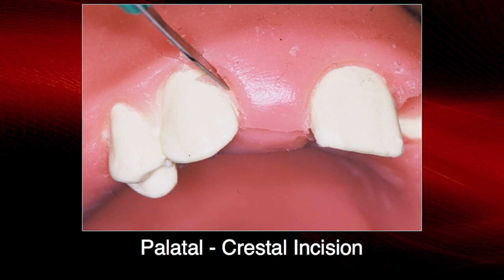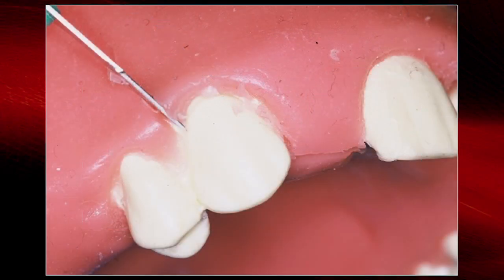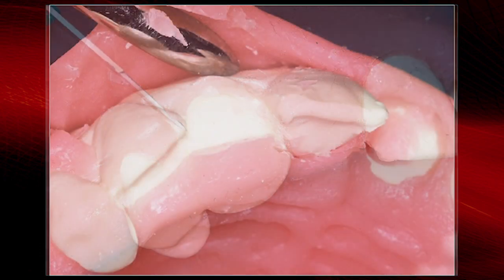So we're making, again, on the palatal side of the crest, we're going to come around the mesial of the adjacent tooth, and if we want to make a more accessible flap, then we want to make our oblique incision between the cervical and the papilla, and the peak of the papilla, in between, so that we don't make a vertical here because we could cause recession, and if we make a vertical at the tip of the papilla, we could blunt the papilla and lose that, and then the patient's going to have a dark space. So then we can have a non-tension closure.